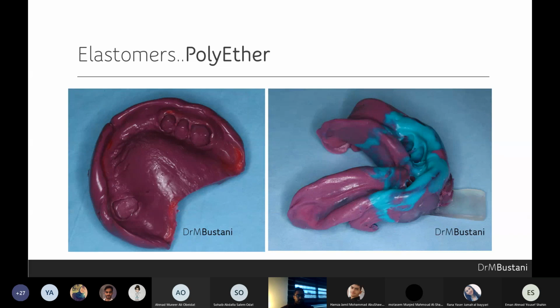But when it's within the tray, it will hold itself within the tray. I won't say it's some sort of viscous material within the tray, but when you have it in a syringe and syringe it around the teeth and then place it inside the mouth, it will be more flowy and lighter in consistency than the material that is within the tray itself.